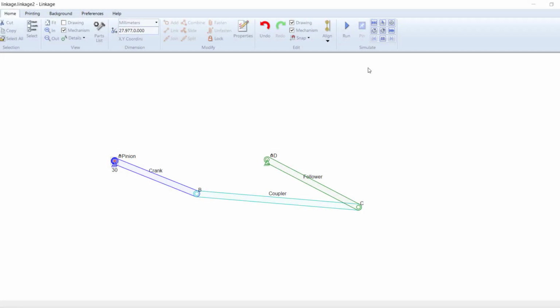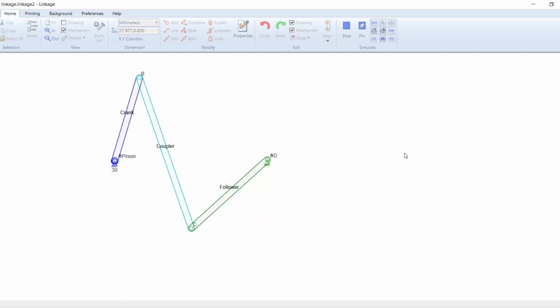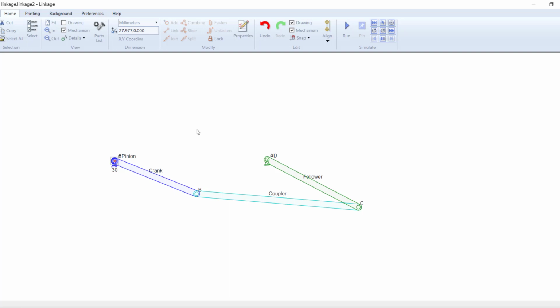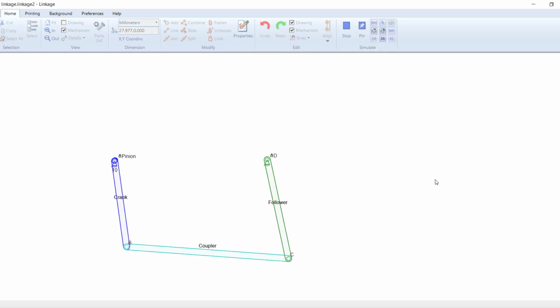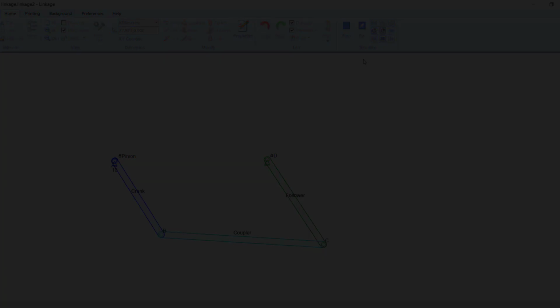Linkage software was used to generate the 4-bar linkage mechanism that was utilized in the transitional unit that converted the manual operated wheelchair to the stair climbing wheelchair. From the simulation, the team ensured that the linkage performed perfectly and did not cause extra strains such as excessive compression or tension in a member of the linkage.